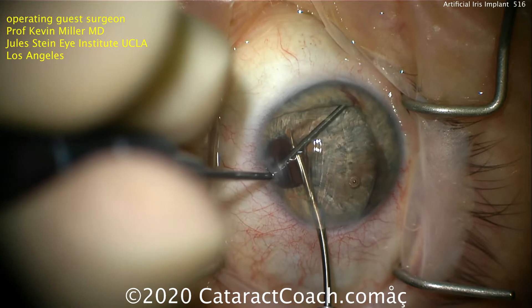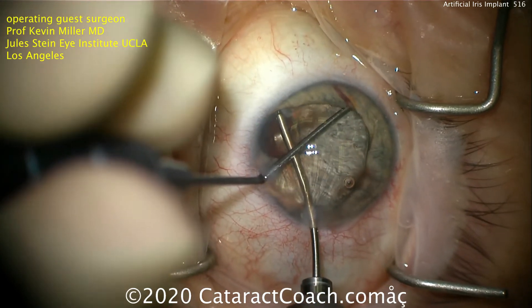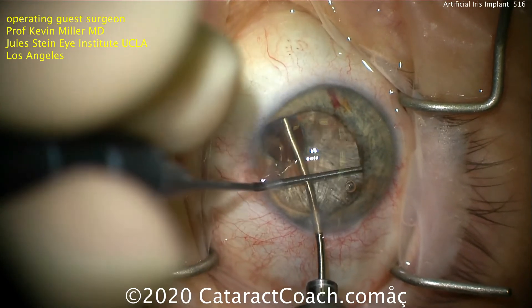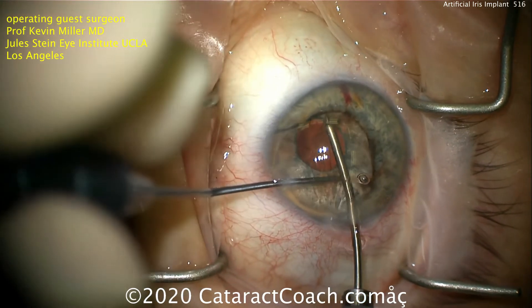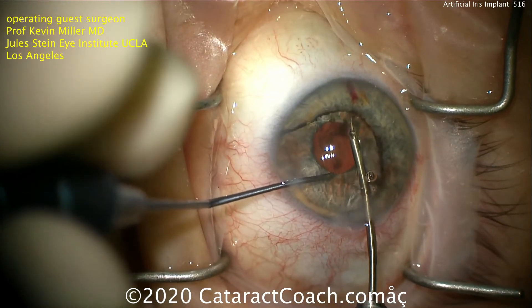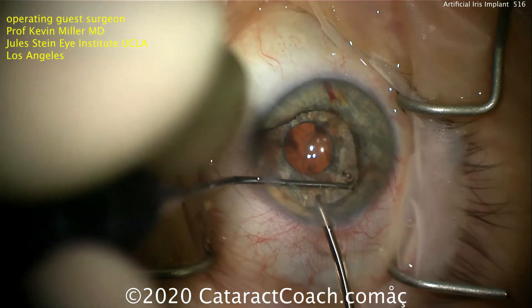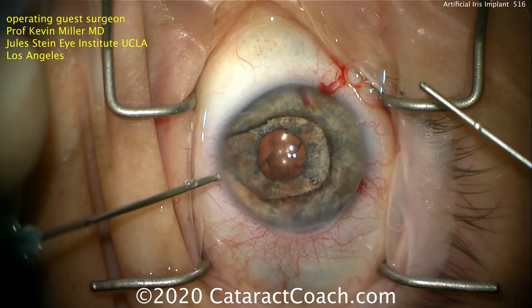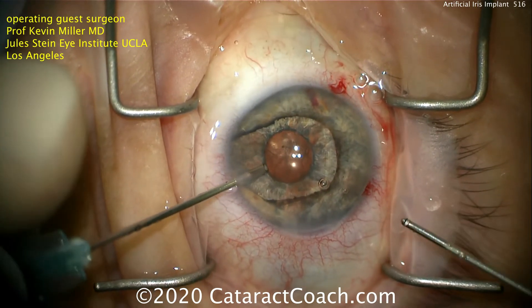So the placement of this is in the ciliary sulcus, and it needs to go behind whatever iris remnants are left in this patient. Fortunately, this device is flexible, and again, Kevin Miller has done hundreds of these patients. I've never personally used this implant, and I find it fascinating because Dr. Miller has such a vast experience, and he's in my hometown of Los Angeles, so it's very easy for me to refer patients to him.